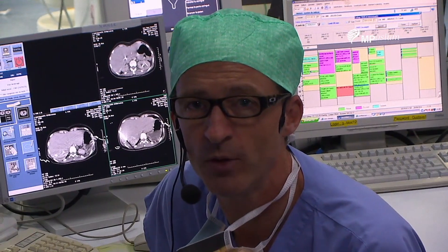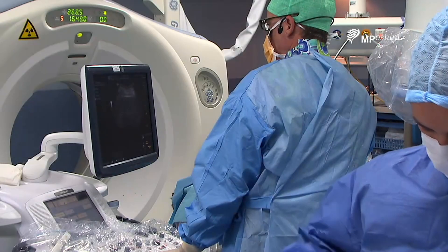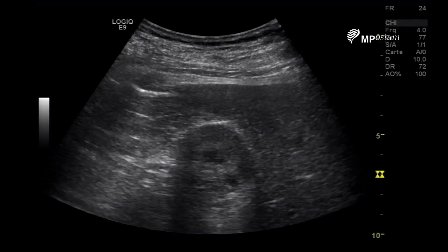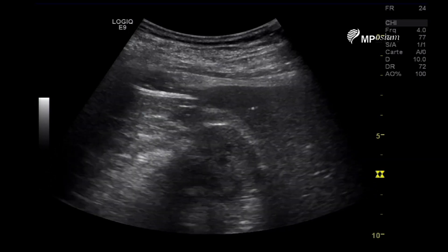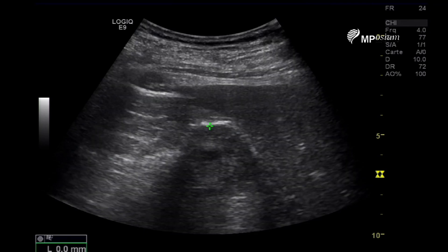I will likely use four ice-rod probes trying to get a large volume of ablation. The procedure will be ultrasound guided because the tumor is nicely seen under ultrasound. The patient has been placed in prone position under general anesthesia and I'm now scanning the tumor which is between the kidney and the liver. You can clearly see this tumor which is measuring in the range of four centimeters.